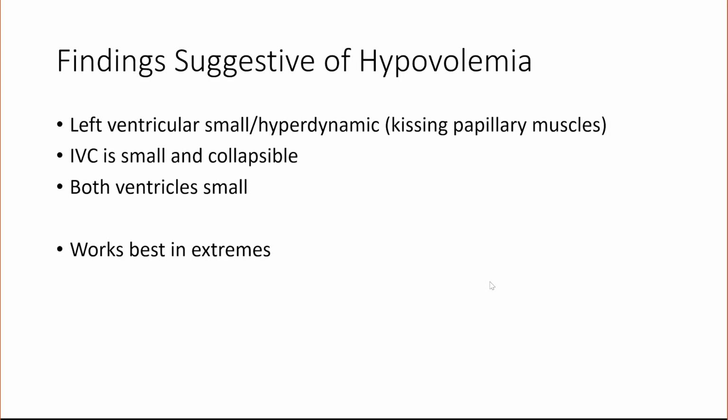But again, volume status assessment with an echo has this problem that it works very well in extremes, where sometimes you can get clinical assessment also that the patient is dehydrated or fluid overloaded. It's where the clinical assessment is dubious that you require a lot more skill to assess with the echo what the volume status is.